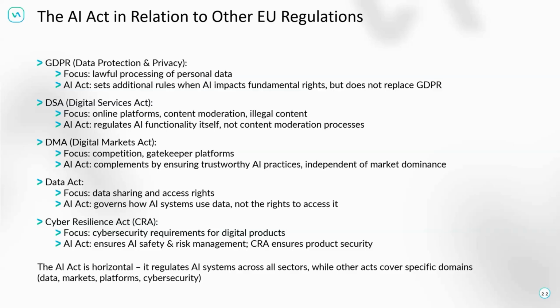The good thing is, when you look into software as a medical device or AI in a medical device or AI as a medical device, the MDR is the main regulation which drives nearly every one of the documentations, and the AI Act is an add-on.